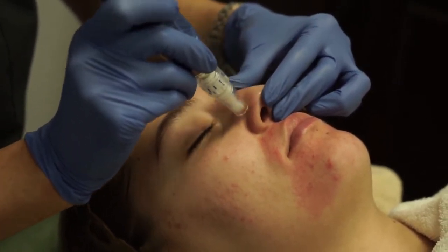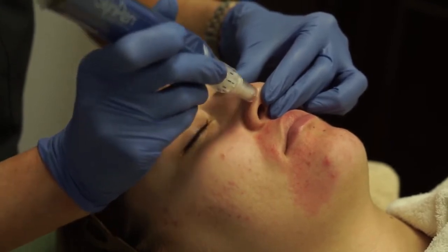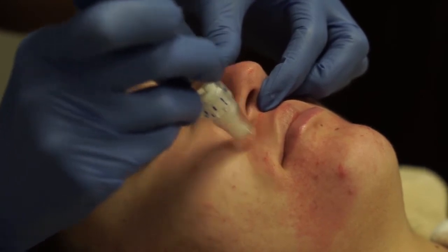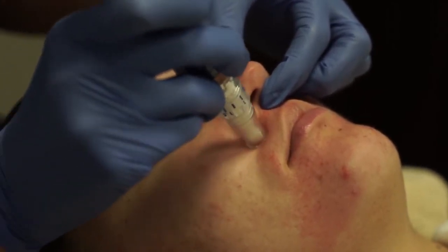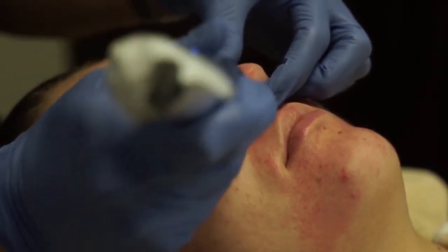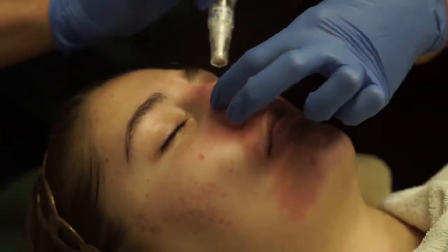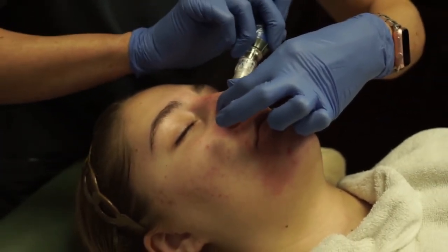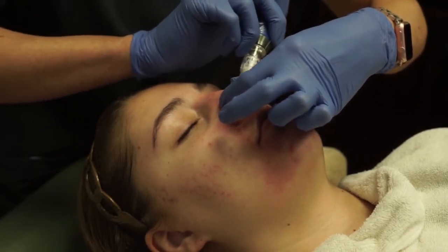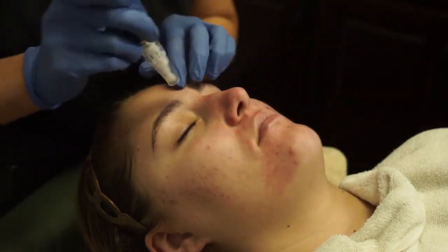You may also ask them to breathe through their mouth and raise a hand in the instance they feel the need to sneeze. It is a little harder to complete full vertical, horizontal, and/or circular strokes depending on the area of the nose you are treating. You may need to gently bend the nose to gain access to the creased areas. Be mindful of the number of passes you make and the skin's response, overlapping as necessary. The depth range suggested for the nose is 0.25 millimeters to 0.75 millimeters.